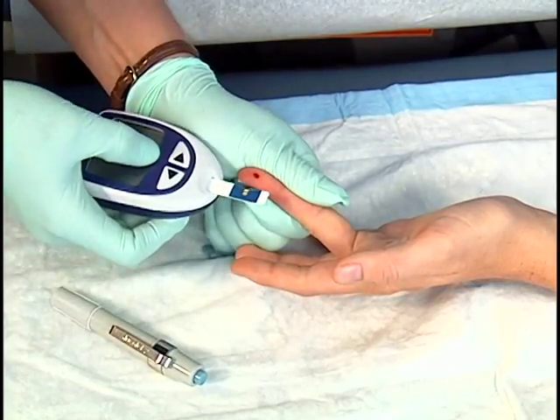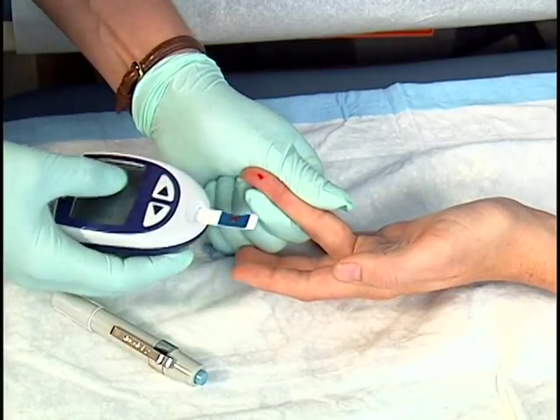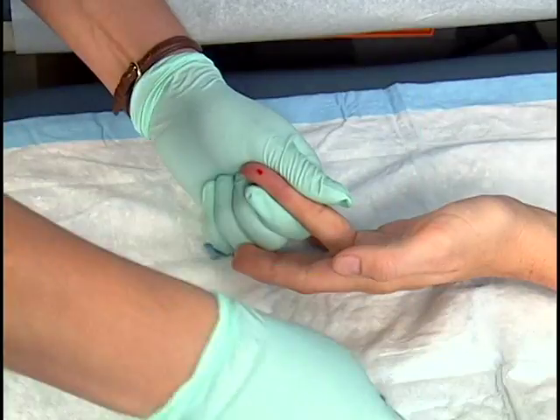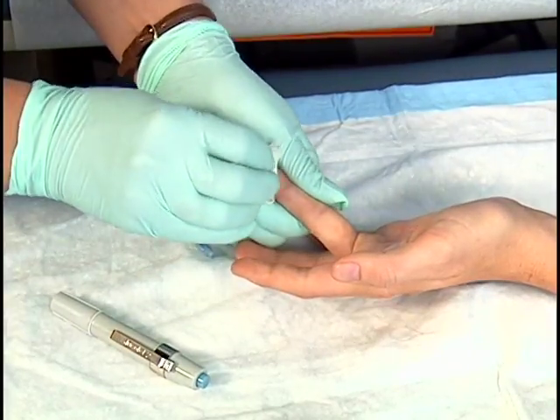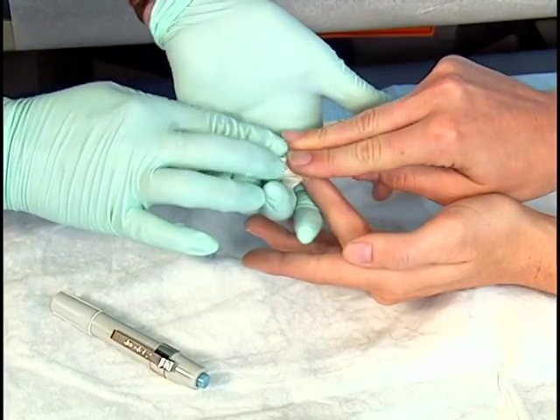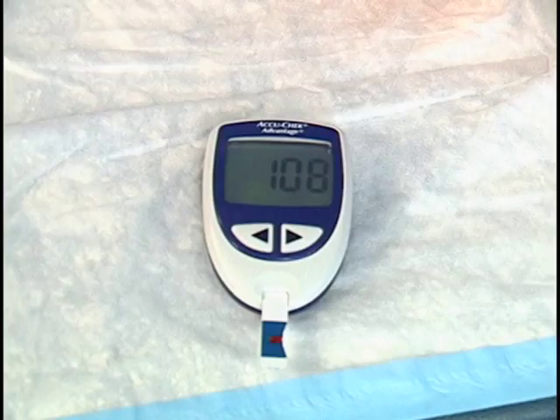Allow a large, well-rounded drop of blood to form and collect the blood specimen. This specimen is being collected on a test strip for a blood glucose determination. Ask the patient to hold a gauze pad over the puncture site and apply pressure until the bleeding stops. Test the blood specimen as required by your medical office policy.